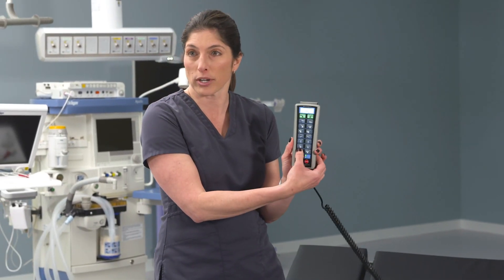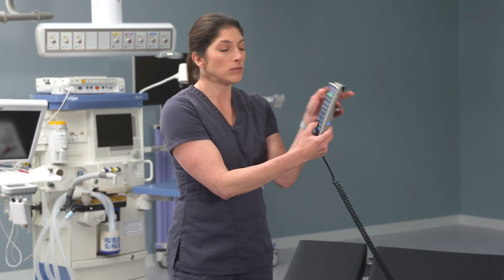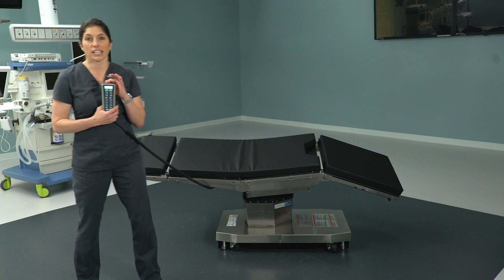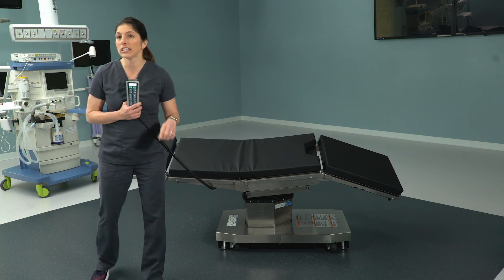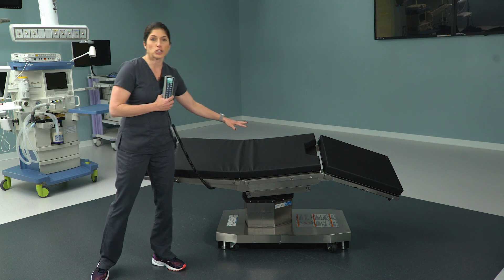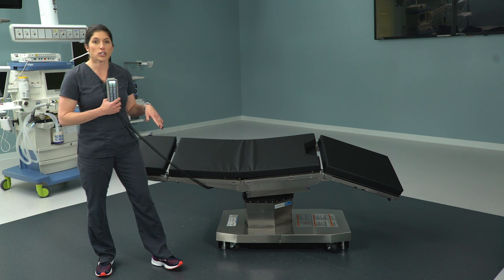That brings us to another nice component of the 5085: the auto-limit sensor. What just happened is I tried to raise the kidney bridge and it wouldn't go. You might look at the hand control screen and see that it says 'back down.' That is indicating we are triggering the auto-limit sensor — the 5085 has an auto-limit sensor built into it that prevents any portion of the table from colliding with another section or portion of the table.